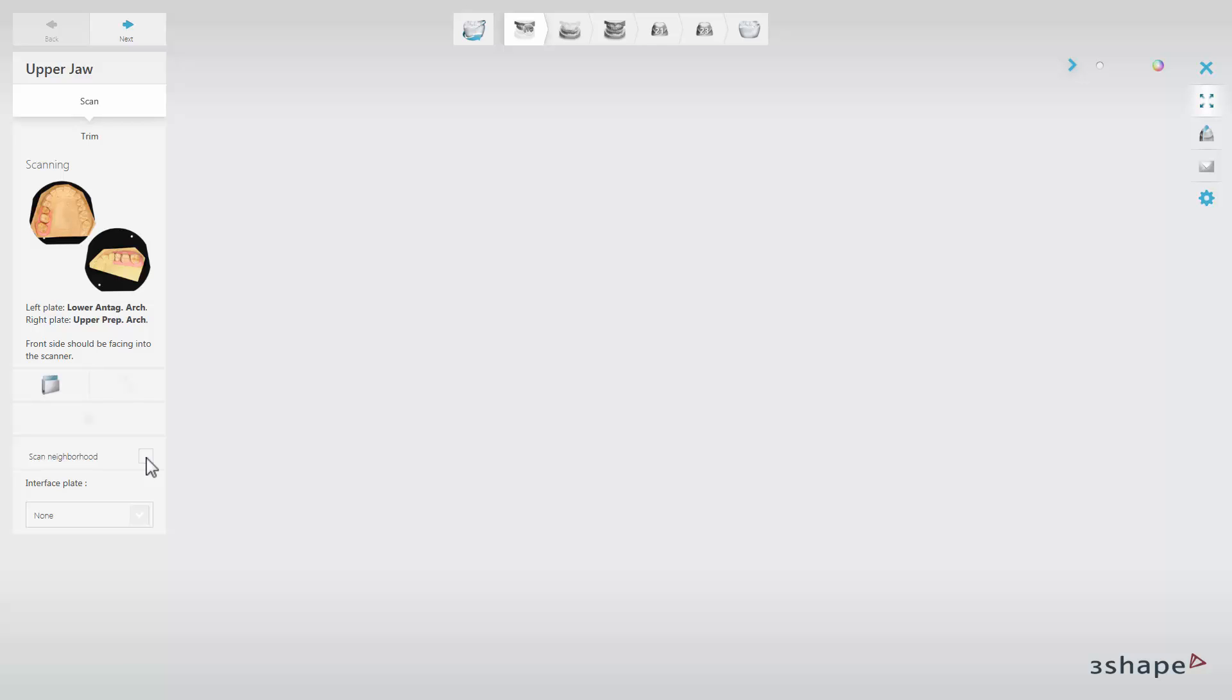Another option available here is called Interface Plate. In the Interface Plate drop-down list, you can select one of the two methods of skipping the bite. Choose either the Calibrated Articulator interface plates or the Occlusion Setup tool for cases that are not fixed in an articulator.